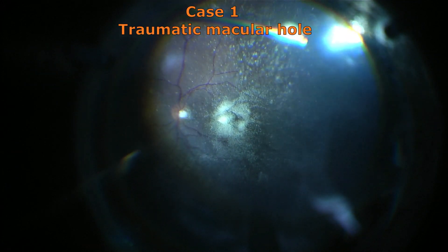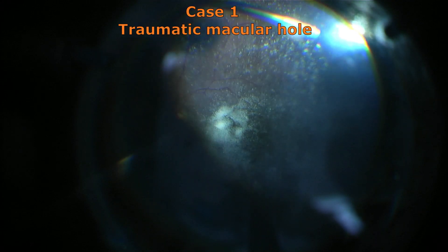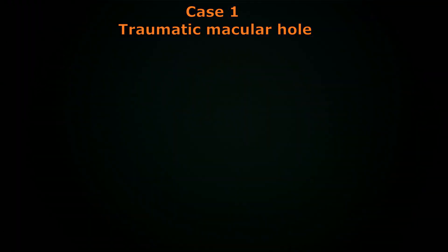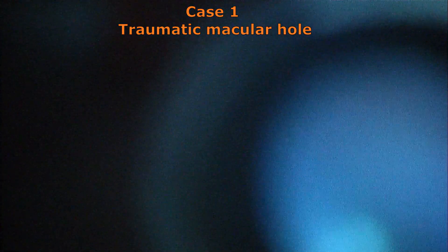It is essential to access the surface of the retina where the internal limiting membrane lies. So once that step has been completed, one has to stain the internal limiting membrane using supravital dyes, and here we have used brilliant blue dye as provided by AuroLab.